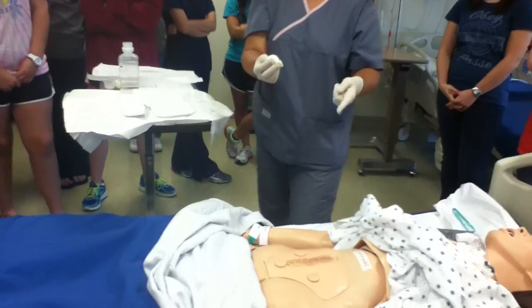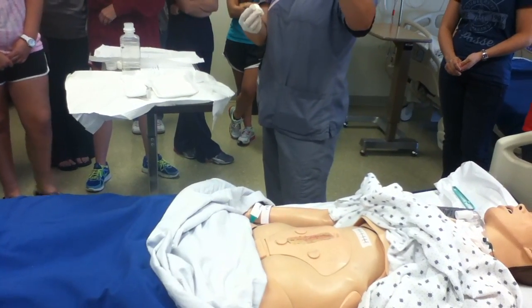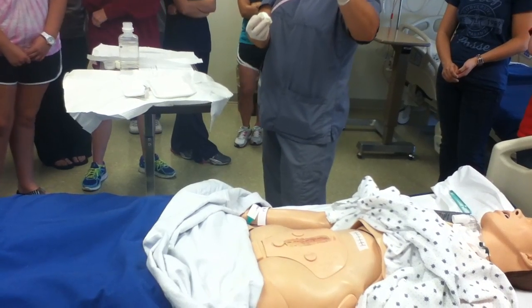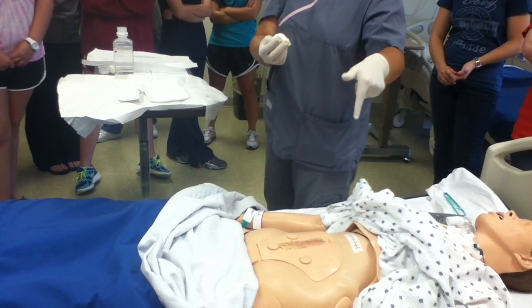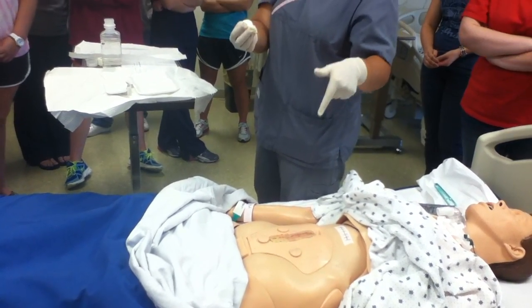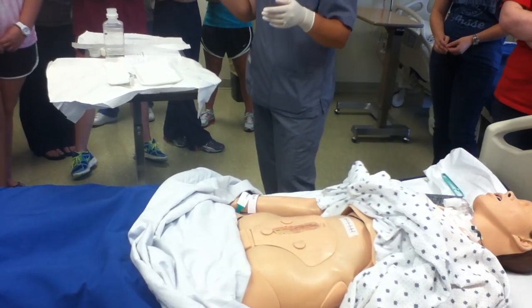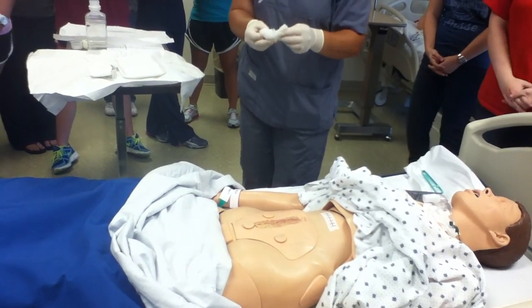Okay. Now, there is a suture line. Do you remember what Miss Nora said up there about cleaning the suture lines? You are going to have to do both of them. You are going to dress this one, but you are going to tell us how to clean that one. So the correct way to clean the suture line would be, and again, I'm going to keep pretending like I'm getting a new 4x4, is what I would do.